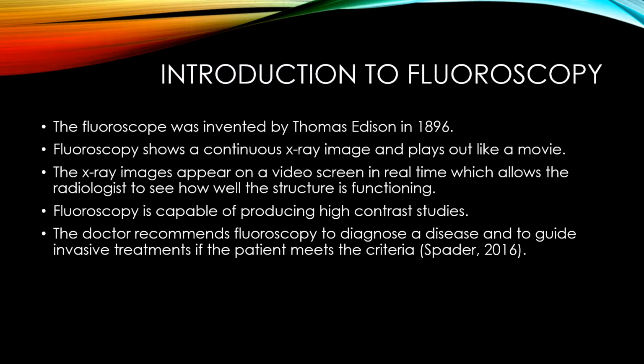Compared to a radiographic examination, the primary purpose of a fluoroscopic examination is to visualize dynamic images. This dynamic radiographic exam has the ability to provide an active diagnosis.